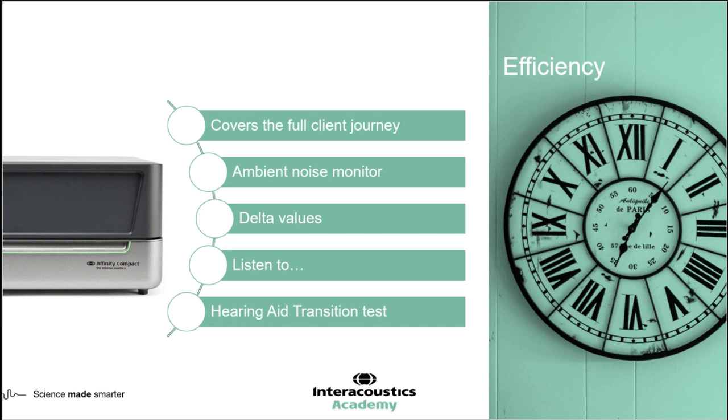The hearing aid transition test is another really nice feature. This allows you to move a patient from one hearing aid to another whilst retaining the audibility settings that they like. I think this is great if you're introducing another type of hearing aid to see if they do better with that, or you want to introduce them to another hearing aid that has different features, but actually you've spent a lot of time fine-tuning their audibility settings and getting it as right as possible. You don't necessarily want to have to start from scratch all over again. So that's a really nice feature which hopefully reduces the time taken and improves efficiency.